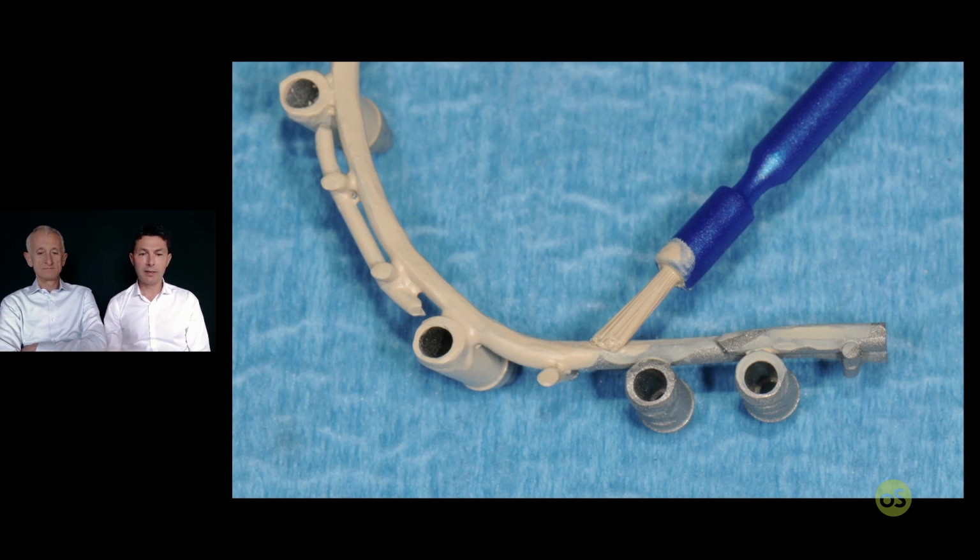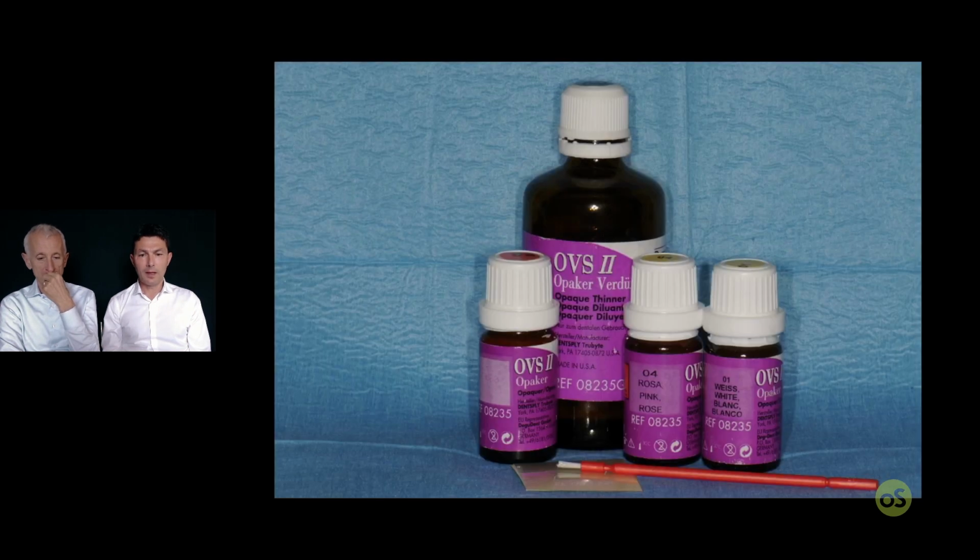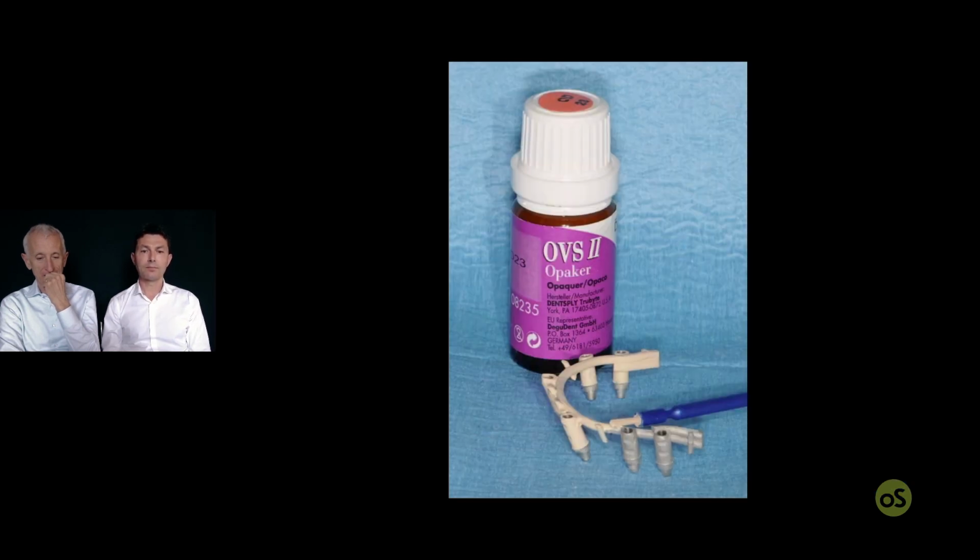I like this opaque very much because it's very easy to cover the gray color of the metal, and this is self-curing. And this is a big advantage, especially in your office. This is the opaque. It's possible to have dentin or pink color.